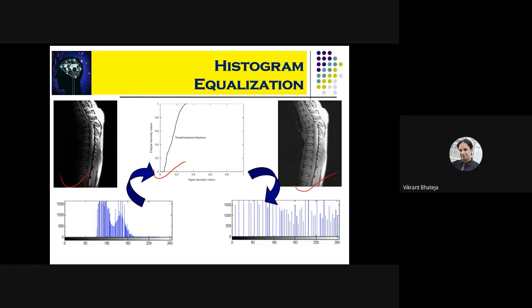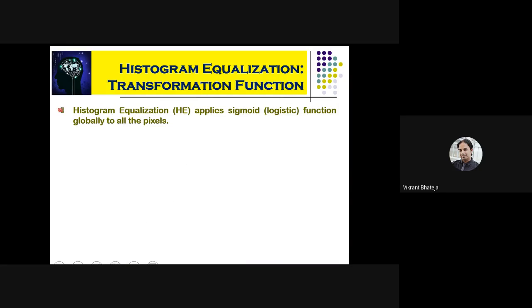So you see that mathematically, you have an initial histogram, say, which is very narrow, and you are giving these pixels to a transformation function, some certain mathematical function, and this is how your histogram gets spread out. So this is the mathematical background of histogram equalization. It is just a kind of transformation function which is trying to recover some of the apparently lost content.